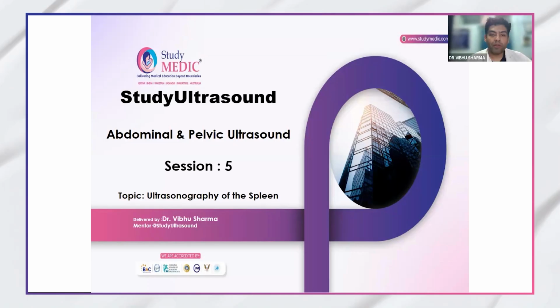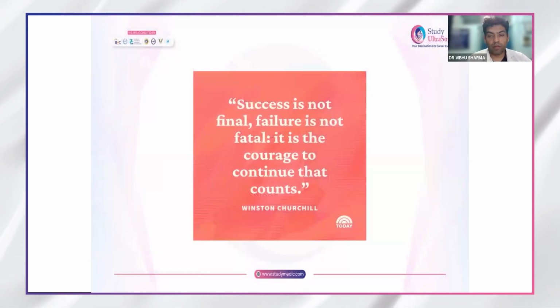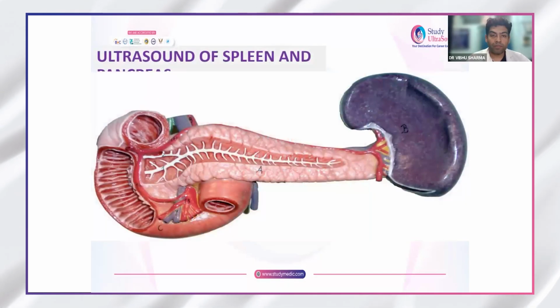Okay, hi everybody. Today another session on ultrasonography of spleen. This is part of abdominal and pelvic ultrasound imaging. I'm Dr. Vibhu Sharma conducting the session, and this is the spleen. As you can see anatomically, spleen is in left upper quadrant along the pancreatic tail.